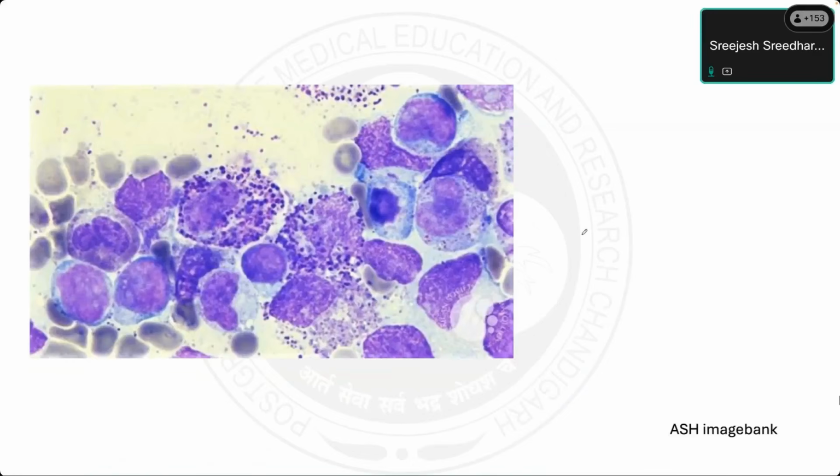Swati or Ruchika, anyone? Eosinophils with black granules? Which AML, cytogenetic abnormality associated AML shows these kind of eosinophils and precursors?